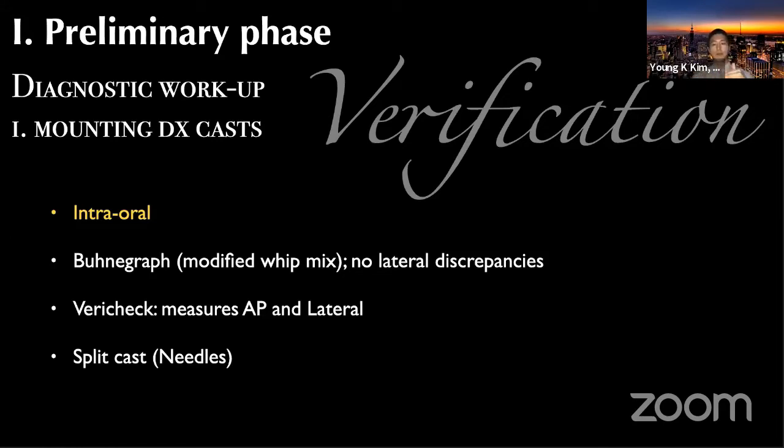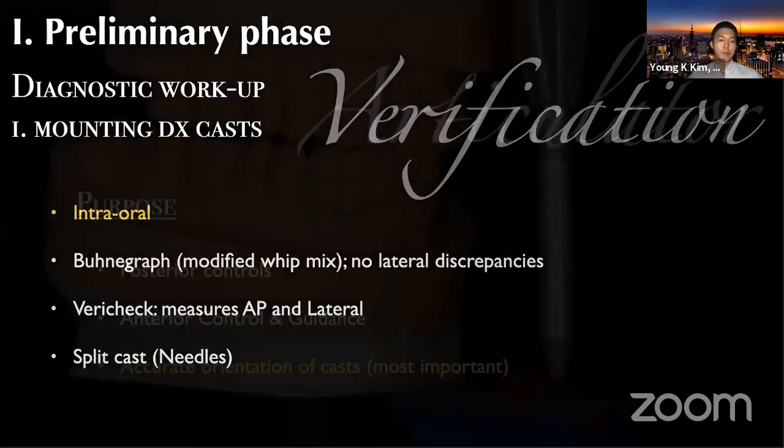What I do is I cut the deep occlusal surfaces, so that I can prevent any unnecessary arc of closure, preventing the passivity of the bite registration, and then passively seat the bite registration as the patient slowly bites down. And that will sort of generate our future occlusal rehabilitation. That will be the starting point. That will be the reference for our next movement, next action plans for our rehabilitation. So it's absolutely critical: verify intraorally.